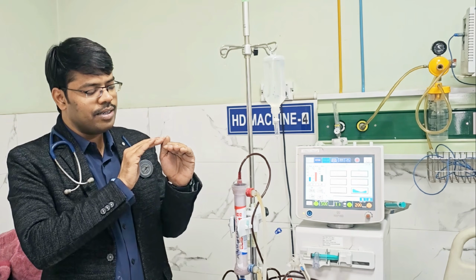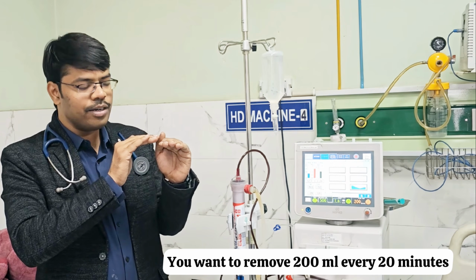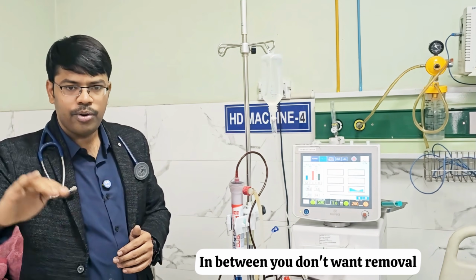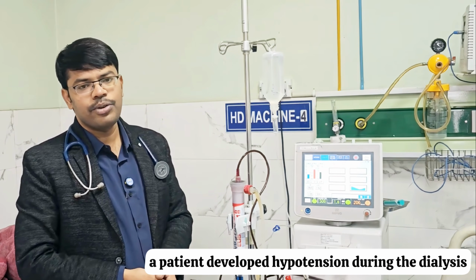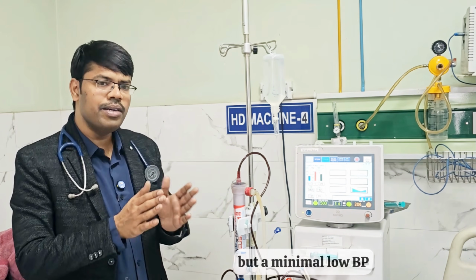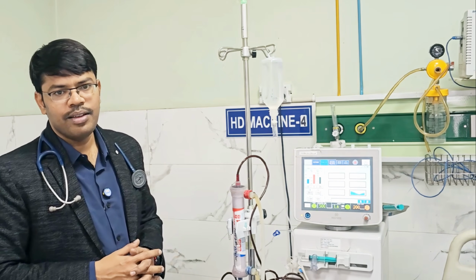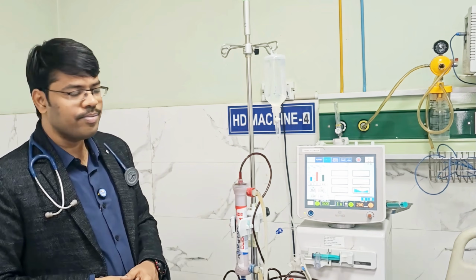Sometimes you want a stable graph. You want to remove 200 ml every 20 minutes. In between you want to remove more. The graph can be set like that. In between you don't want removal. Let us take an example. A patient developed hypotension during the dialysis. Not to a level a patient is requiring inotrope, but a minimal low BP. For next 20 minutes we don't want ultrafiltrate, and the graph can be set accordingly. The water removal from the patient can be graphically set.